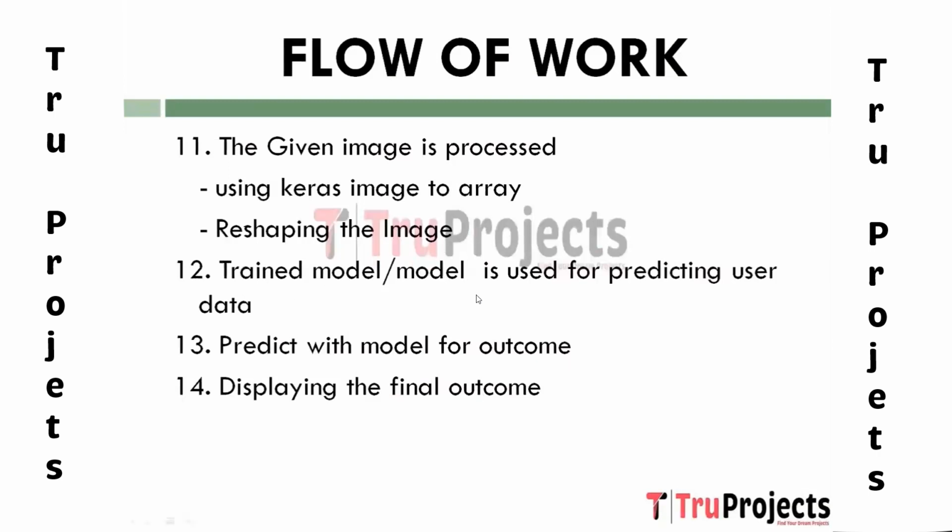On 12th, here we have the trained model. Our model is used for predicting user data, employing the previously trained deep learning predictions to make the predictions on the user's uploaded data, in this case likely COVID-19 detection in the image.